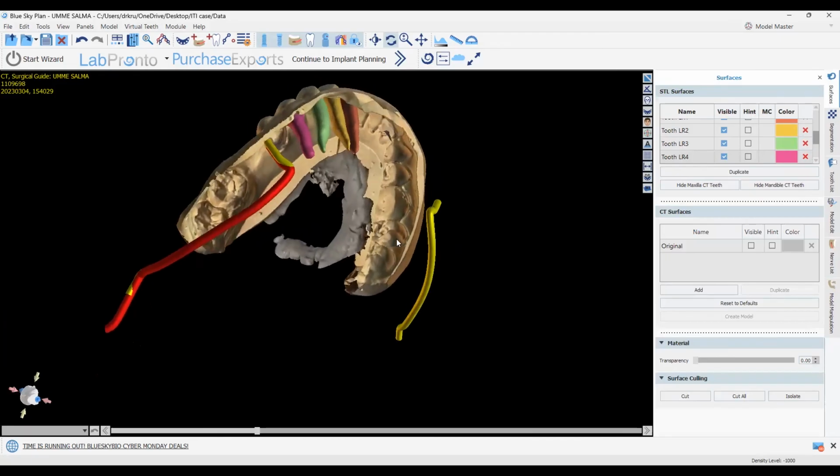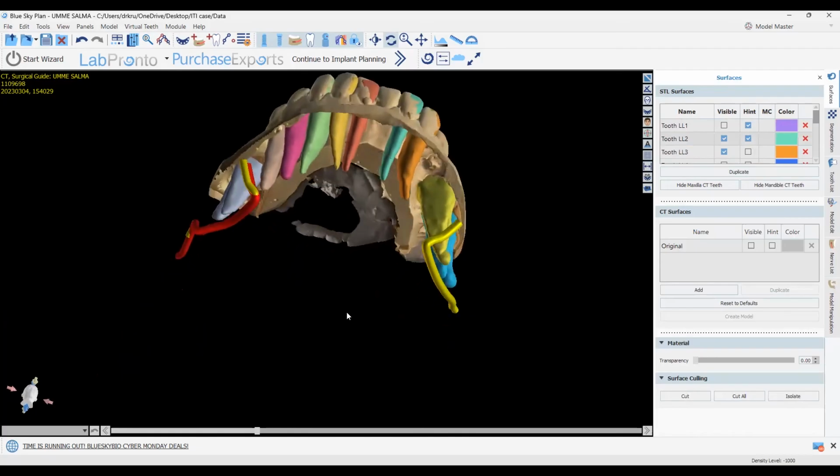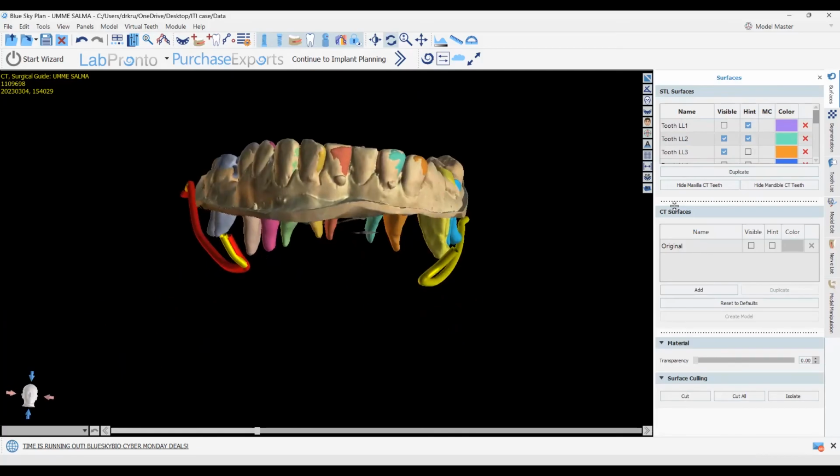I hope you can see there, it is perfectly aligned. So the advantage of the segmentation is to determine whether they are perfectly aligned. Okay. So this is how the alignment is done.